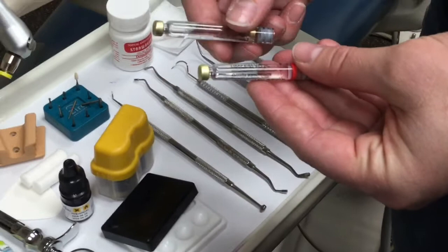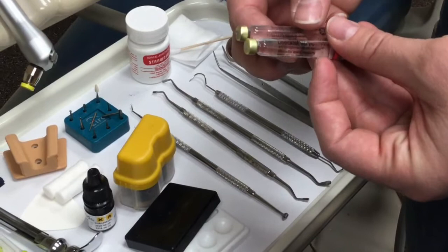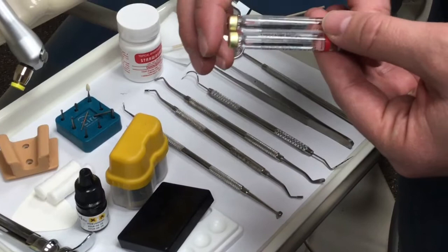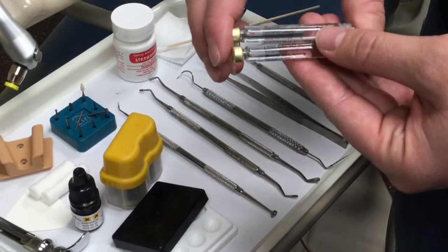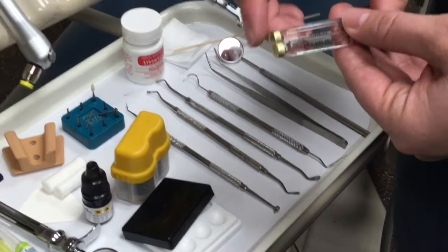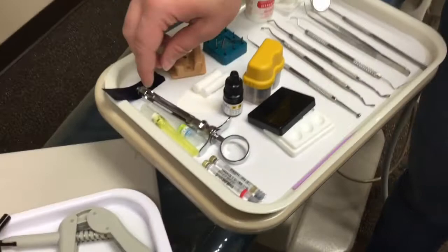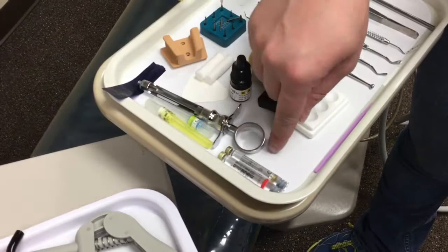If somebody has a heart problem, high blood pressure, or anything to do with the heart, we don't want to use epinephrine on them. So what we would use is what's called carbicaine — an anesthetic without epinephrine. Along the same lines, on the higher end of the epinephrine side is marcaine, which is typically used for oral surgeries or really tough extractions. It's always a good idea to put one loaded with your capped needle and then keep an extra one on the tray or on your clean surface.